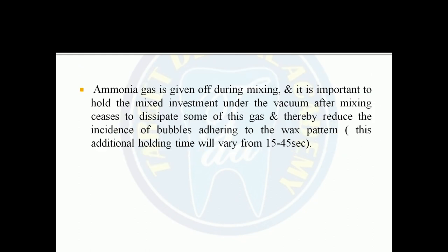Ammonia gas is given off during the mix, and it is important to hold the mixed investment under the vacuum after mixing. That helps to dissipate some of this gas and thereby reduces the incidence of bubbles adhering to the wax pattern. So the additional holding time will be 15 seconds to 45 seconds.